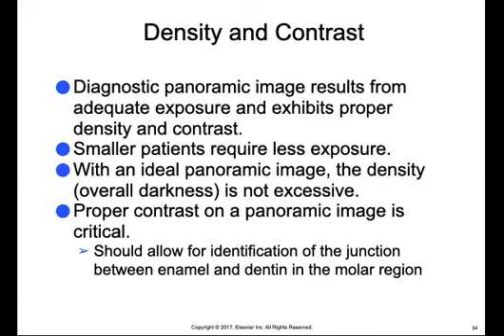So if you have proper contrast, we shouldn't see any of those overlapping images. It should be just one clear, true image of what you want to see. And so inadequate contrast may lead to problems with the detection of unerupted or impacted teeth, just because it's too hard to see with multiple overlapping images.